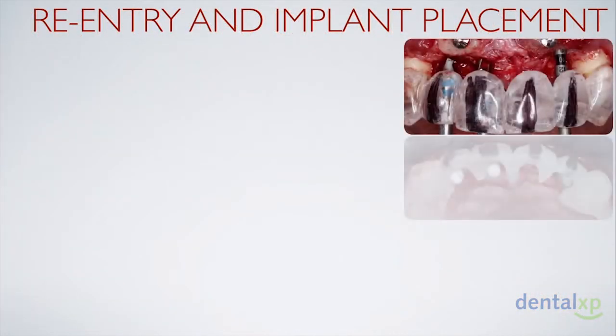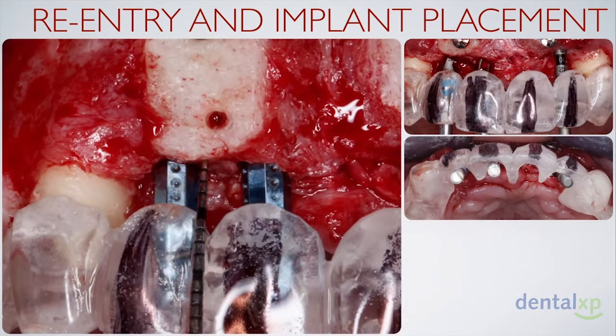Following adequate healing time, the site was re-entered, implant drilling was commenced, and implants were placed in accordance with our final restorative design, keeping in mind all the parameters we previously discussed: the apicocoronal positioning, mesiodistal positioning between the implants, and the buccopalatal positioning of those implants.